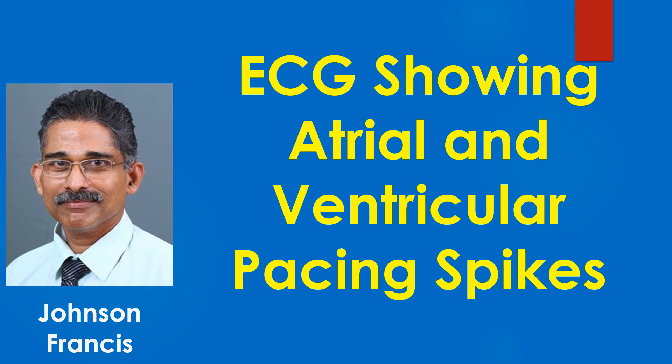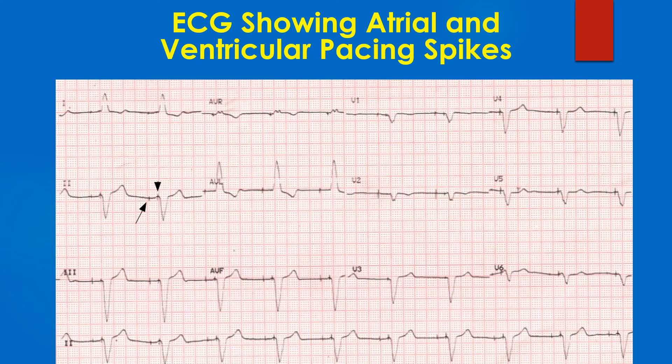An ECG showing atrial and ventricular pacing spikes indicating dual chamber AV sequential pacing is discussed here. The atrial pacing spike has been marked with a long arrow and the ventricular pacing spike with a short arrow.